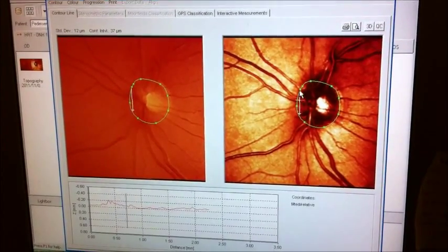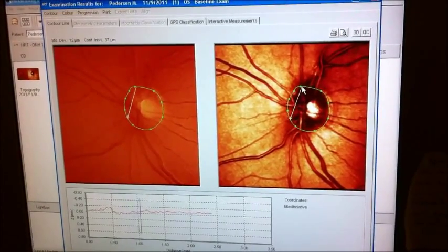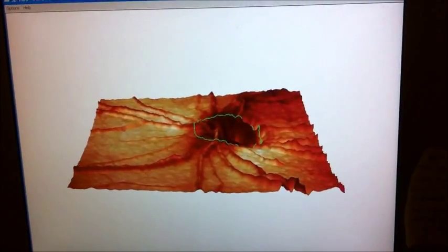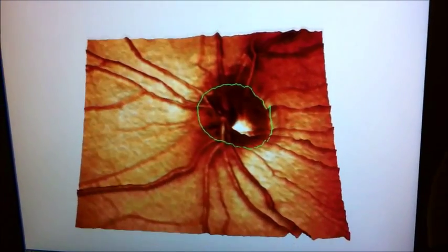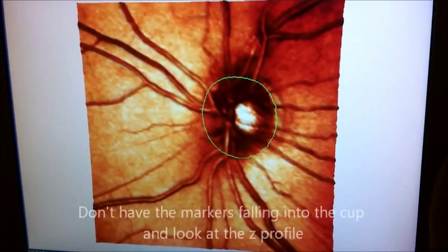I'm putting a few too many markers here, but let's just arrange this. So we're going to say accept contour. Then we can see that's not bad because we're not getting any of the markers falling right into the cup. I think we're pretty good there.